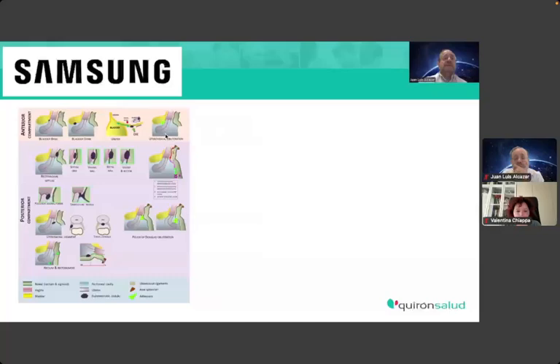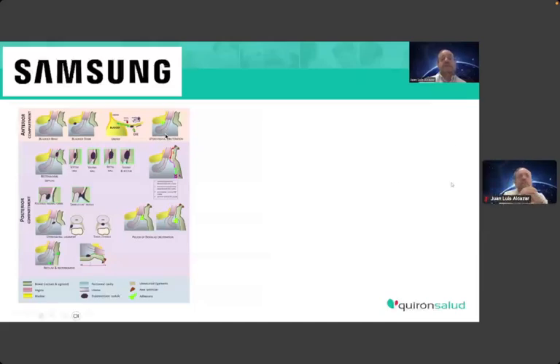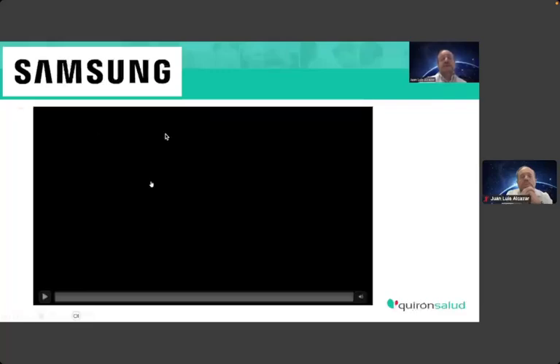And then the IDEA protocol proposed the use of a topographic way to report all these findings when you scan a lady with deep pelvic endometriosis disease.